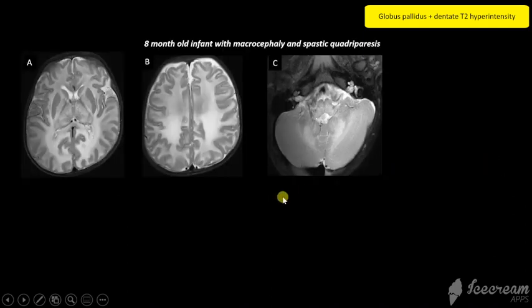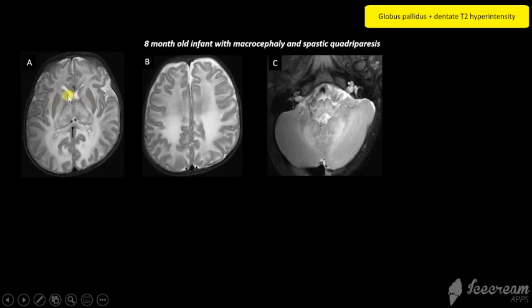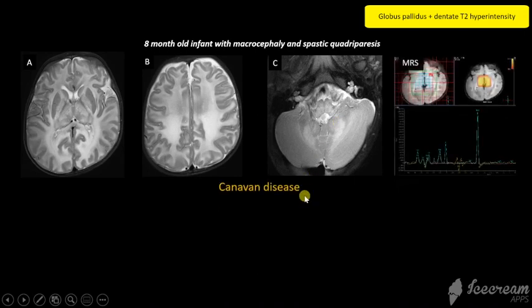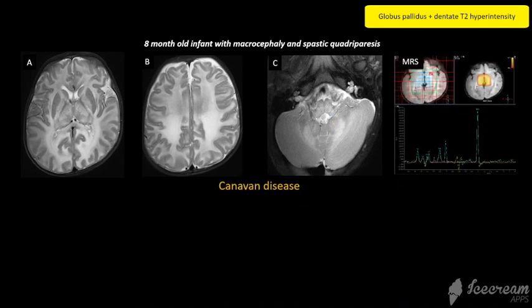Finally, this case shows diffuse supratentorial swelling and hyperintensity with globus pallidus involvement, typical sparing of the putamen and caudate, thalamic involvement, and dentate involvement. Spectroscopy shows elevated NAA, and this is Canavan disease.